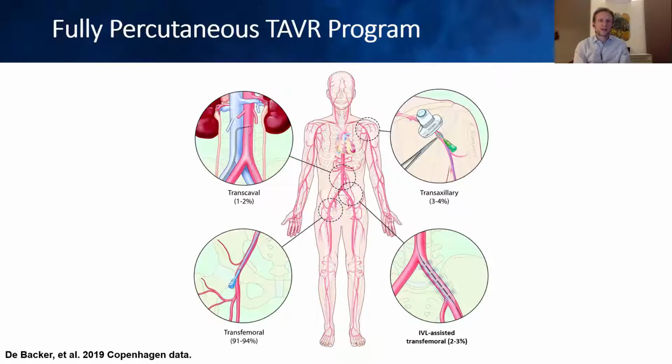And then also another transvascular access approach, the transaxillary approach, which we do fully percutaneous. And then for the last 1 to 2% of cases, we use the transcaval approach. And these approaches will also be shown later in this program.